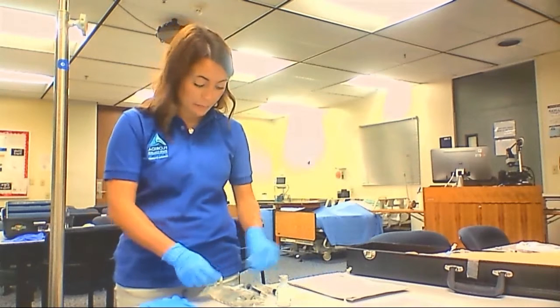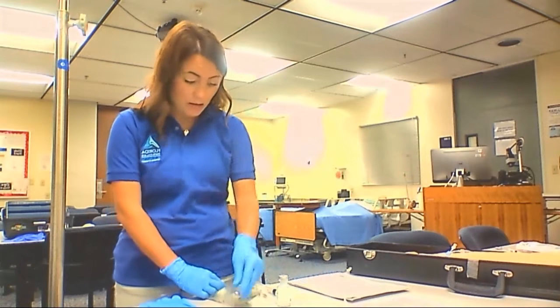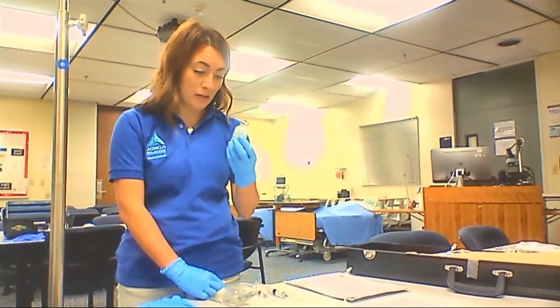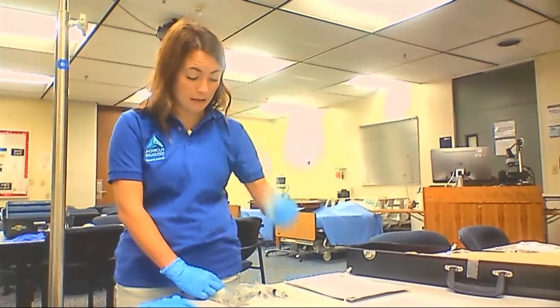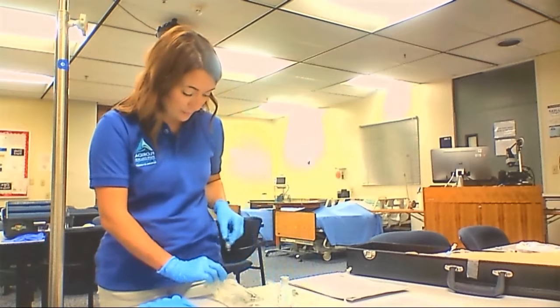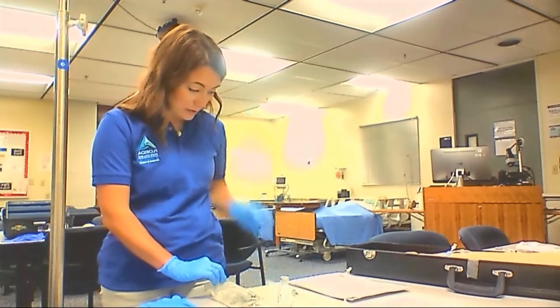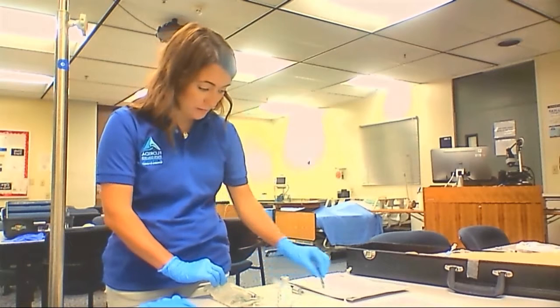So I want to make sure I take an alcohol swab and clean my bag off. I also want to make sure that the vancomycin I'm using has not expired, and it has not. And I also want to make sure that I'm using vancomycin, which I am. I'm going to go ahead and insert this into my bag, my mini bag, recapping the needle using the scoop method.